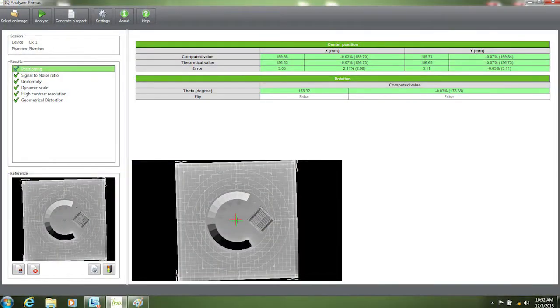The IQ analyzer Primus allows you to do image quality in three simple steps. First you select, then you analyze, and then you report.